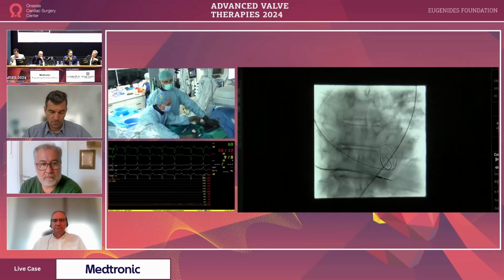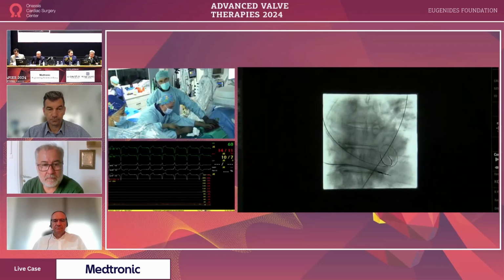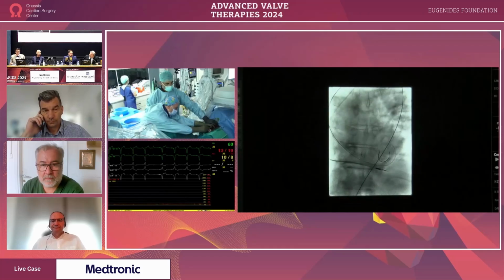So this is a very nice comment, but I think yes, we can try. Maybe we post-dilate later in this valve.